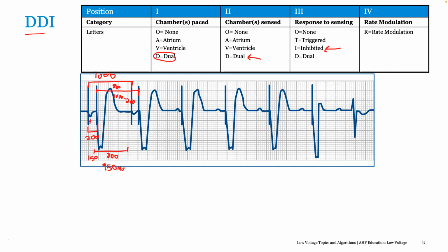So now, for people with AV block, because that is the commonest one we see here, what do you recommend commonly around here? Then also another set of people we see occasionally are those with permanent AF and who had a slow ventricular response.